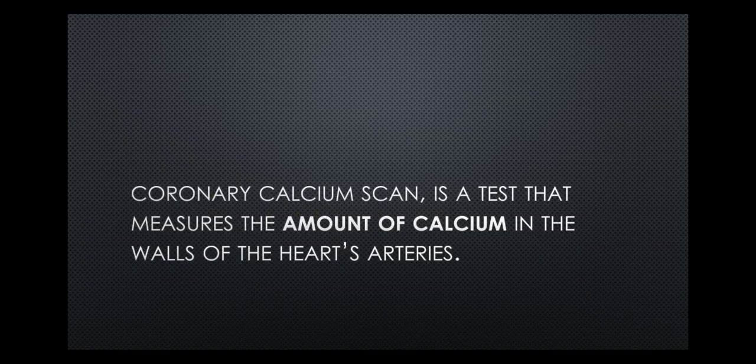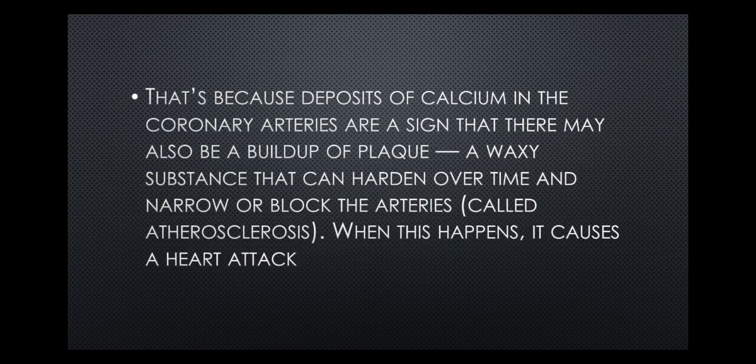Coronary artery calcium scanning. The coronary calcium scan is a test that measures the amount of calcium in the walls of the heart's arteries. That's because deposits of calcium in the coronary arteries are a sign that there may also be a buildup of plaque. Plaque is a waxy substance that can harden over time and narrow or block the arteries. When this happens, it causes a heart attack.